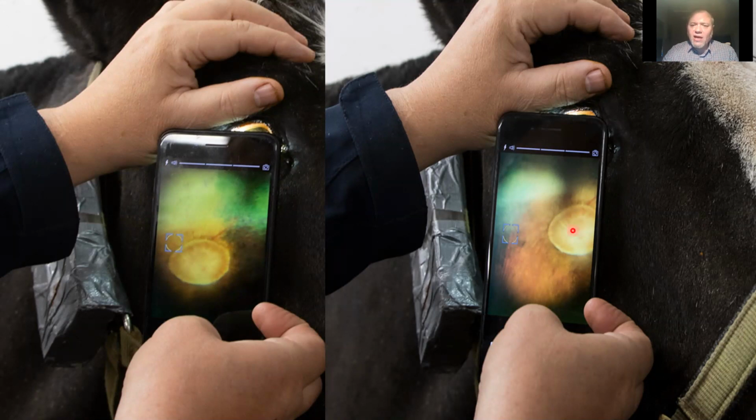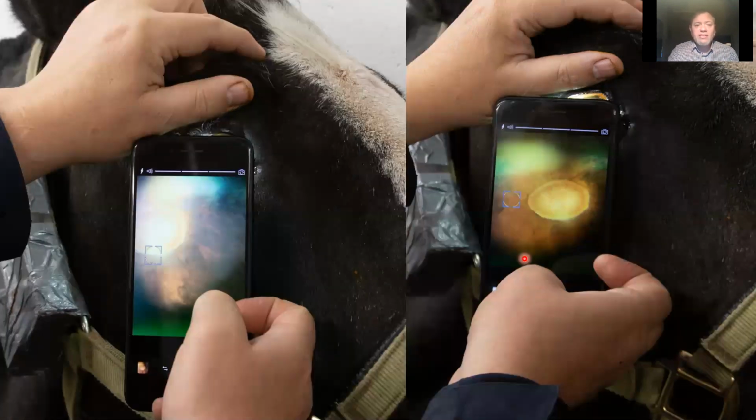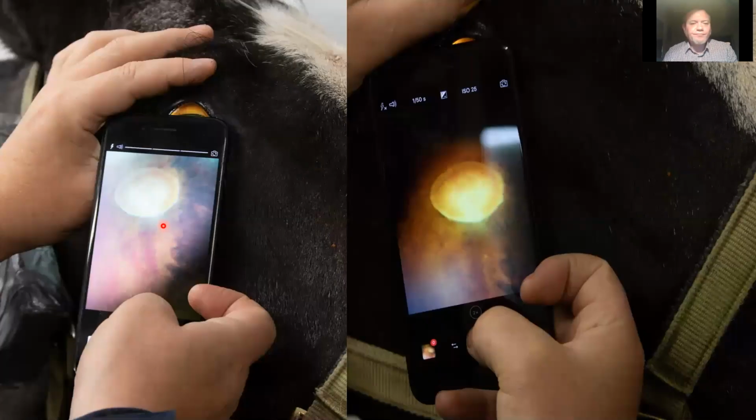And you'll see the optic nerve has become much whiter as exposure has been increased to give us more non-tapetal fundus detail. And in this left-hand photograph, even more extreme, we've actually seen lots more non-tapetal fundus detail, but the optic nerve is now whited out because it's overexposed.